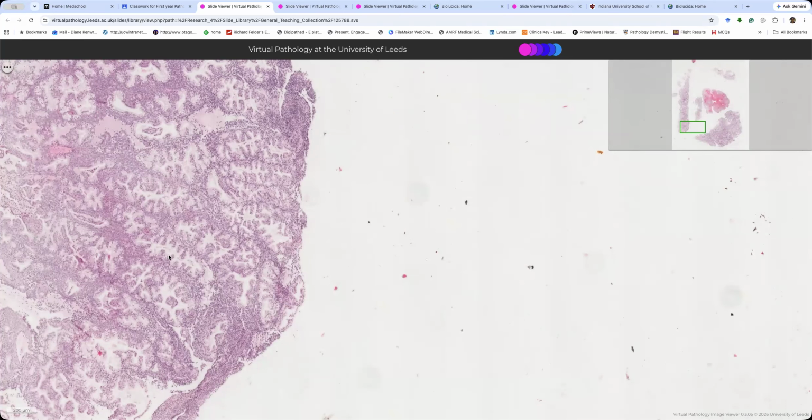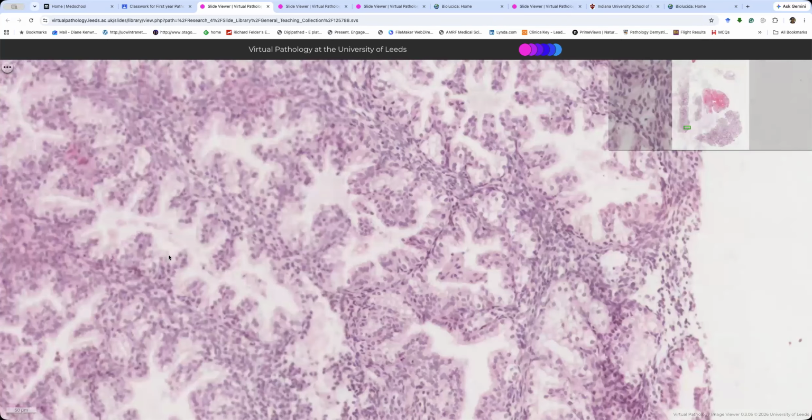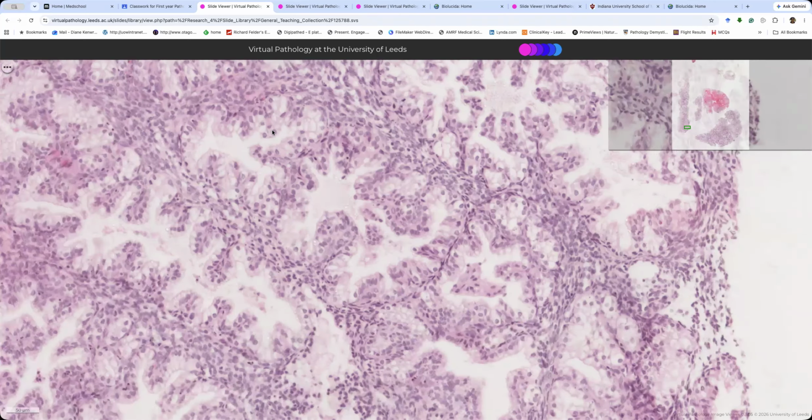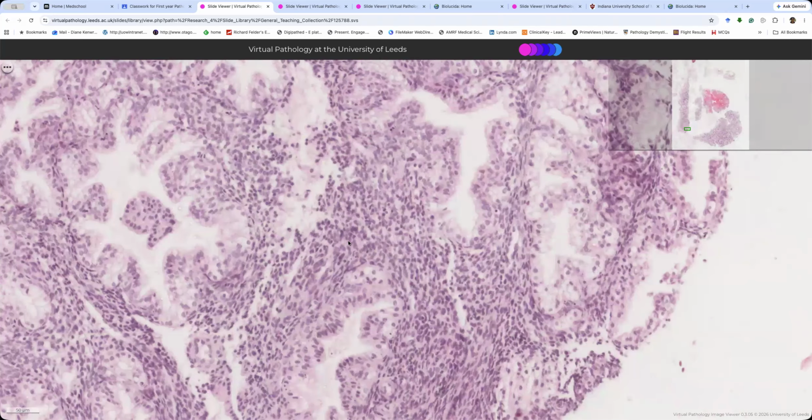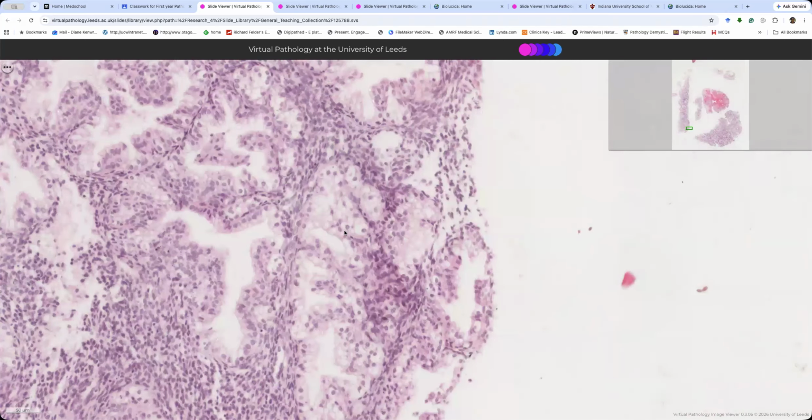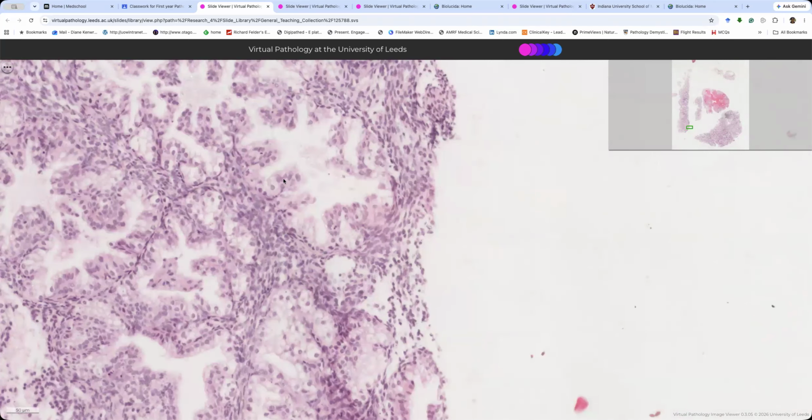This is really, really tortuous, really grown longer than it is wide. And look at the cells, and this is why people get confused with Arias-Stella reaction and cancer, particularly on a curettage where we don't have good architecture. Some of these cells are just a little bit atypical. Where's the atypia gone? You know how you can never find it when your consultant asks for it. Okay, so the registrars here, all right, I can't show you great atypia at the moment, but they are just a little bit atypical, but not as atypical as clear cell carcinoma.